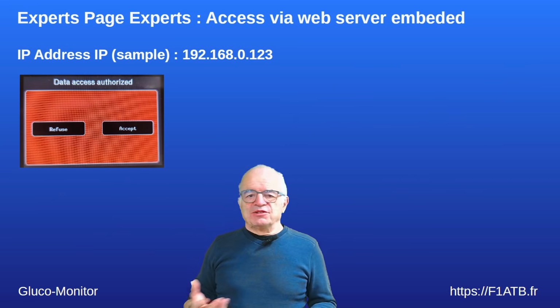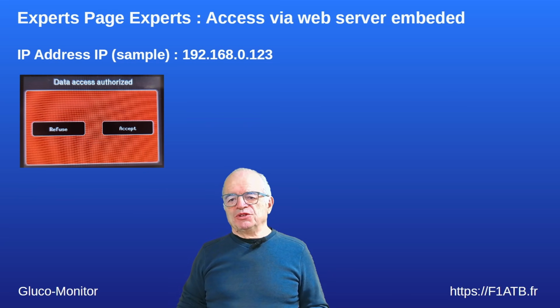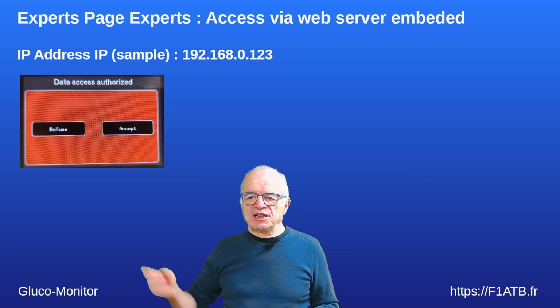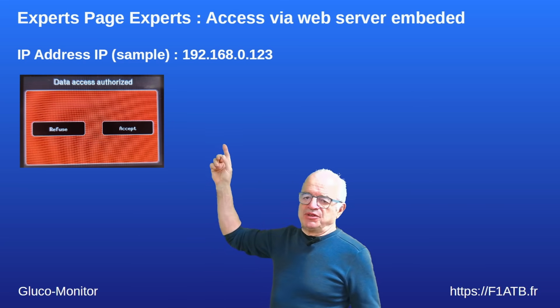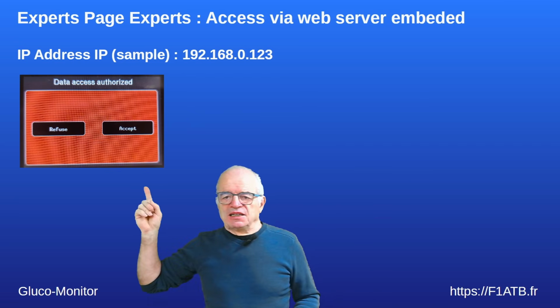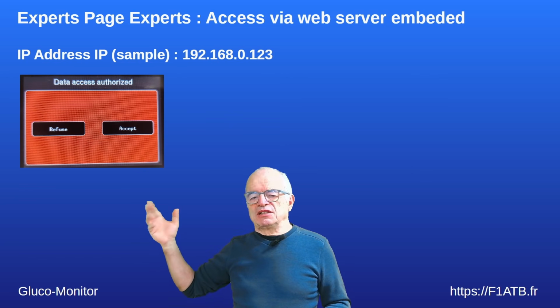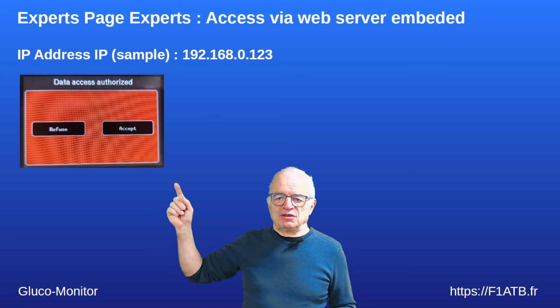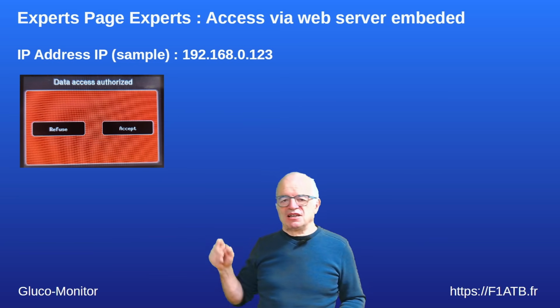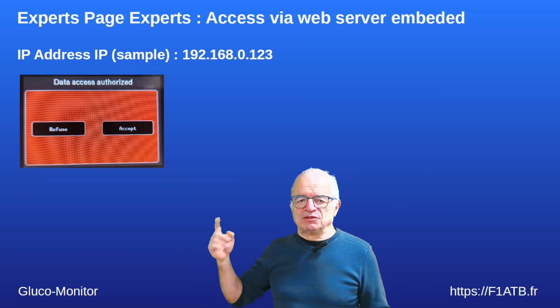If you are interested in understanding a bit more about how Gluco-Monitor works, there is a web server on Gluco-Monitor. You can connect to it using the IP address of the monitor, which is available on the configuration page. Then, to avoid access by anybody connected to your Wi-Fi, Gluco-Monitor asks you to authorize access to the details by the PC connected to the server.